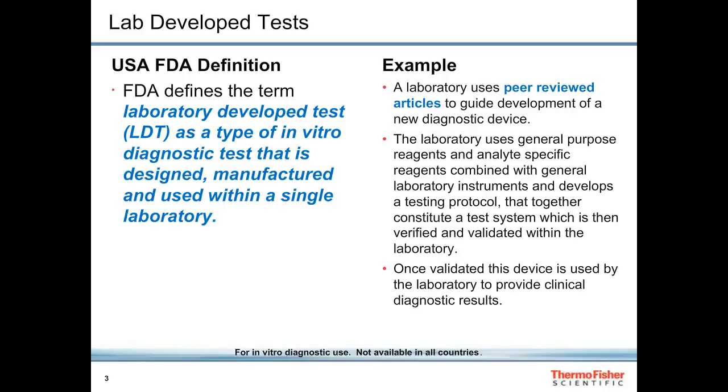When I say in-house methods, I mean laboratory-developed tests, which the U.S. Food and Drug Administration regulates for in vitro diagnostic use. Those who develop clinical laboratory methods typically start with peer-reviewed articles to help them utilize their instruments, reagents, and other resources to run samples and generate data in order to come up with a reliable procedure to measure specific things in blood, urine, or other biological fluids.